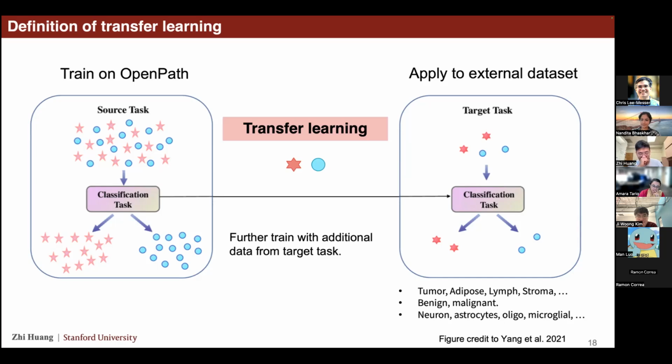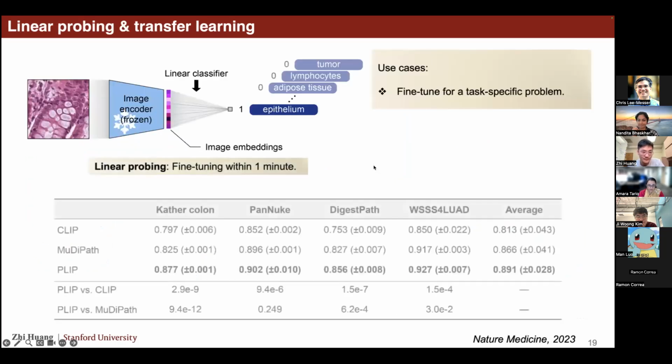It does become challenging in terms of model forgetting if you train extensively on, let's say, 20x in breast tissue, but apply to maybe colon tissue at 40x. That part could be interesting to further evaluate. I haven't done that yet, but I think that could be very interesting, meaning that, to achieve a higher performance, it's better to train a model with the same data, or just maybe a similar data distribution, right? That makes sense.